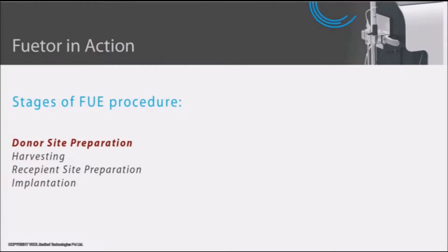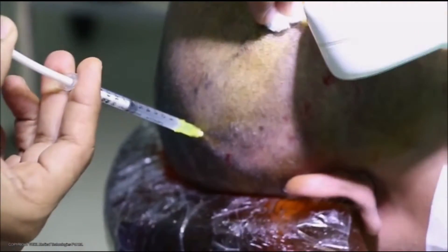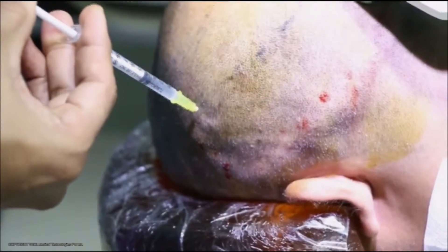The FUE procedure goes through a number of stages starting with donor site preparation. The donor site is shaved leaving behind follicles with little hair. Anesthesia is then administered, followed by tumescence.